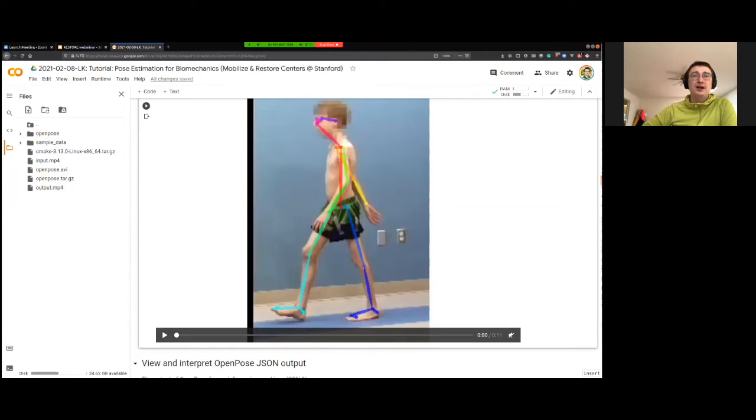If you have a bunch of videos collected in your laboratory and you're interested in some key points in those videos, then you annotate some of those videos, and DeepLabCut allows you to train a model to replicate those manual annotations, and then you could run our workflow as well. So it's kind of complementary, not really competitive in this particular workflow.